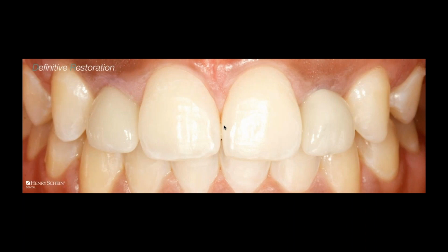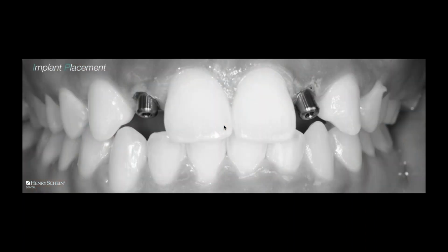And when we look at this and we see where we're at and how we got to this point, the reality is it is because the head of the implants were not placed in an appropriate position. And because of that, no matter what I do, I will never be able to design restorations that will be a therapeutic success. There will be some sort of compromise. So the real question is, how do we get the head of the implants where they need to go?